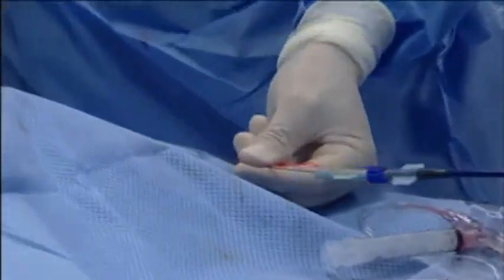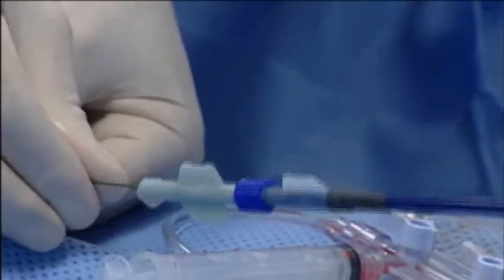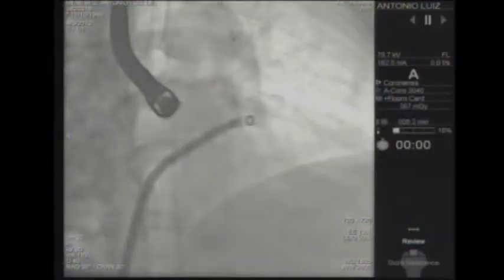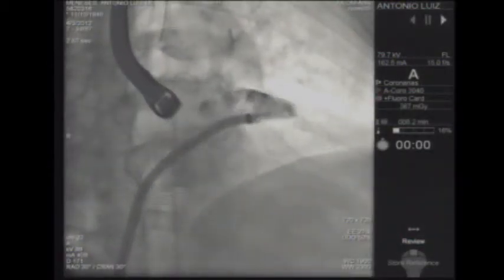Sometimes we have a hard time going transeptal. You have to rotate. Yes, this is a good angle. So it went through the septum easily. So we advanced the sheath into the left atrial appendage. Let me show you some pictures here. Okay, so this is the picture.